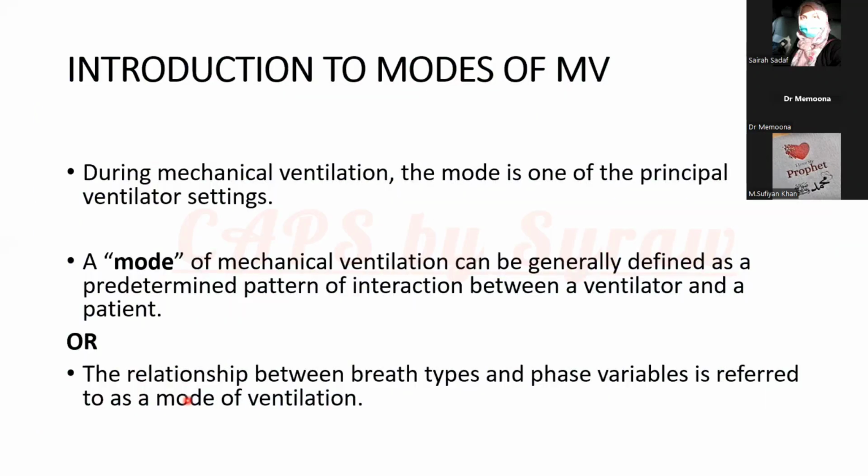Now we come to the main topic. First, we have to know what a mode of mechanical ventilation is. A mode of mechanical ventilation is defined as a predetermined pattern of interaction between a vent and the patient, or it is the relationship between the breath types and different phase variables.